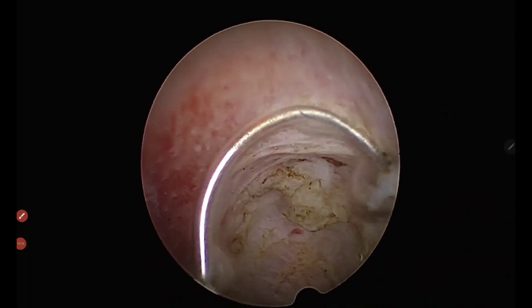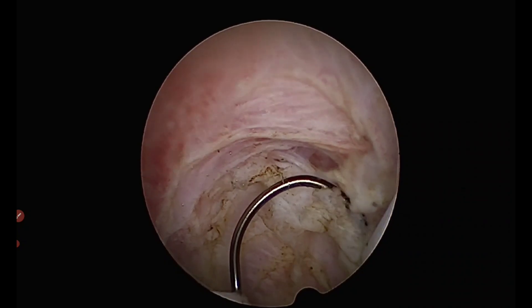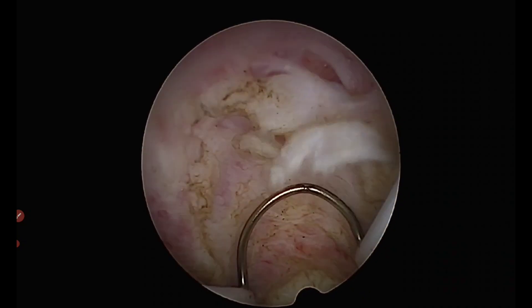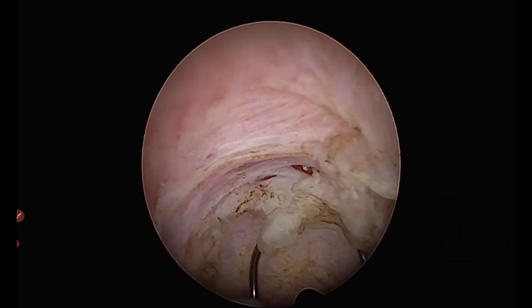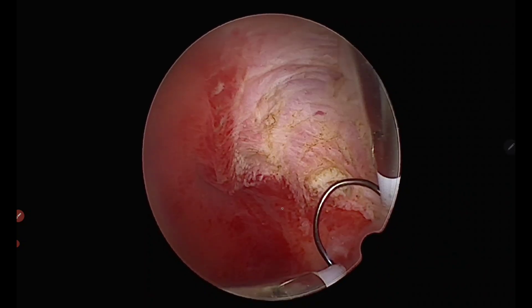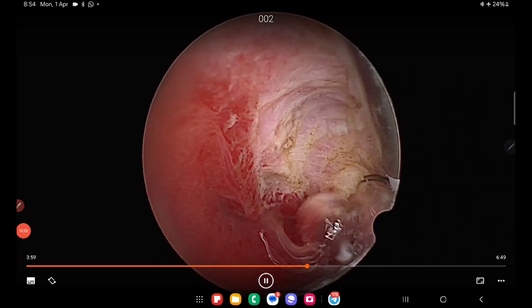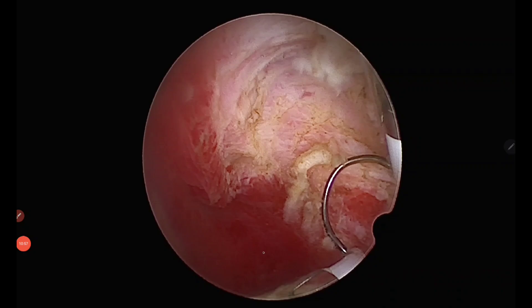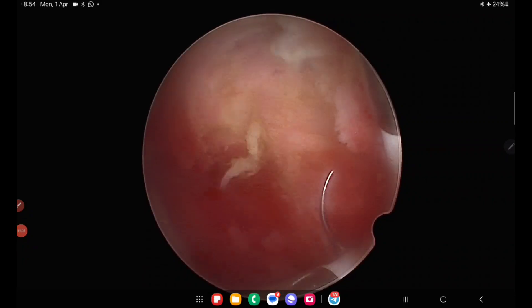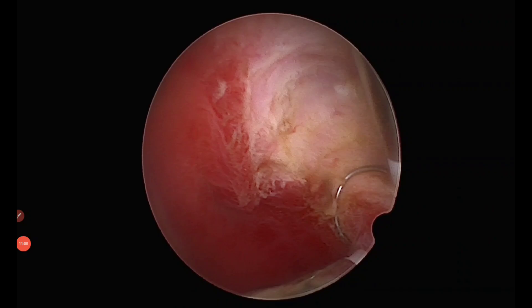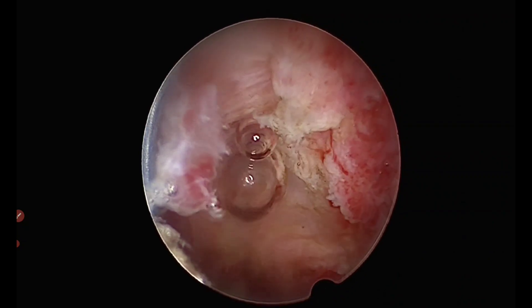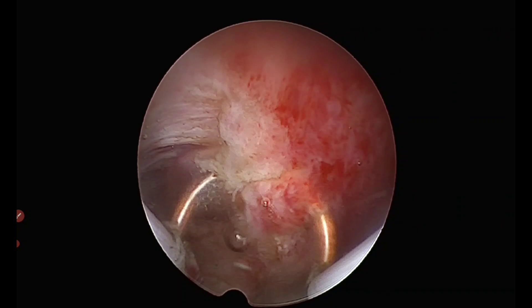I continue cutting, dislodging smaller pieces with very small bursts of current. At this stage, if the hand is not well coordinated, pushing with the resectoscope loop may result in perforation of the fundus of the uterus — so one must be very careful with this maneuver. The entire mass has now been removed; what is seen behind is completely myometrial fibers, confirming that the fibroid has been completely enucleated. Intraoperative ultrasound can reconfirm this, but given the size, location, type, and clearly visible myometrium, one can be 100% sure the fibroid has been removed.